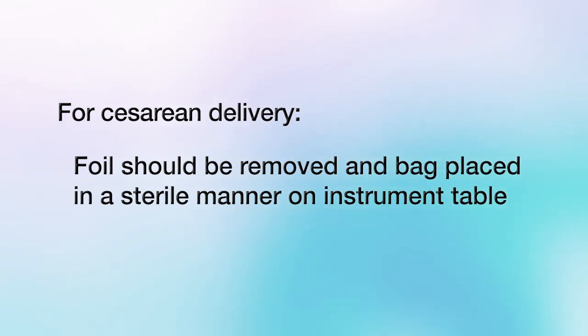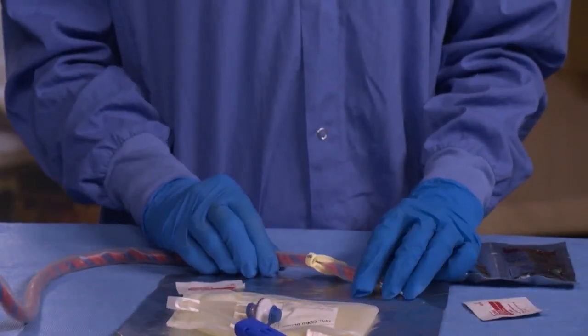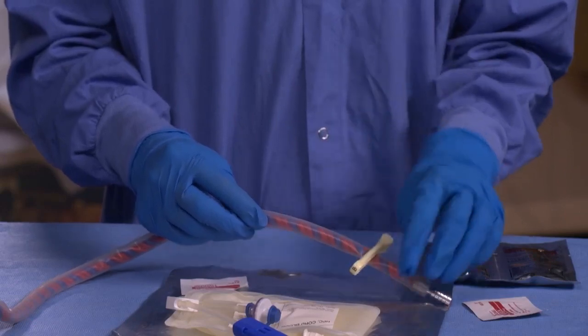In the case of a cesarean delivery, the foil should be removed and the bag placed in a sterile manner on the instrument table. The placenta is still in utero, so choose a venipuncture site near the distal end of the umbilical cord.